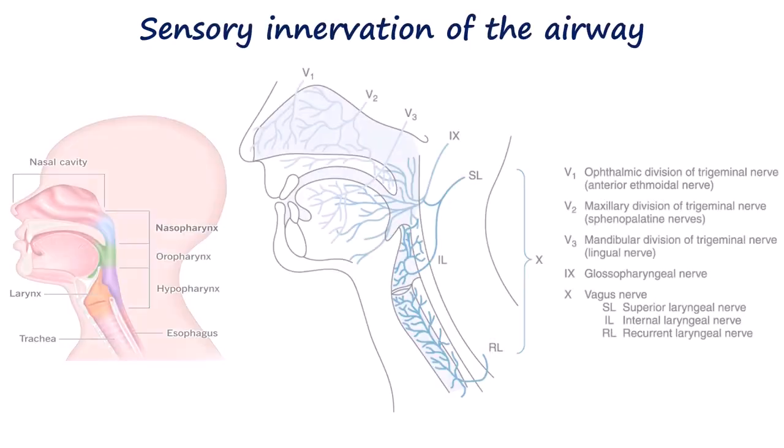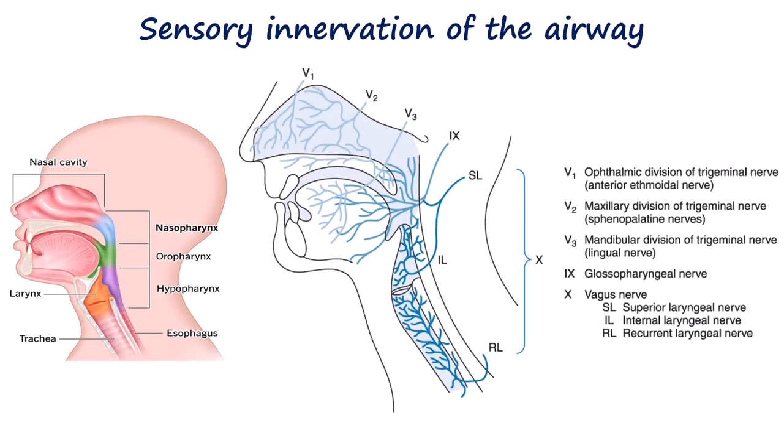In our last video, we went over the sensory innervation of the airway and why it matters. These nerves and the regions that they supply are exactly what we have to target when we prepare someone for fiberoptic intubation. The idea is simple. If we can block or numb those areas properly, we can prevent reflexes like gagging, coughing, or even laryngospasm, while still letting the patient breathe on their own. So in this session, we'll go through how we can numb or block the airway.